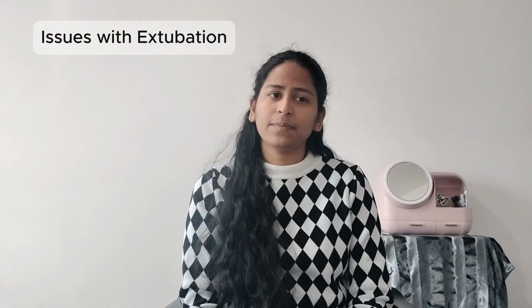Another important thing to remember is always have your bag valve mask or Mapleson C circuit ready while you're extubating. This could mean that any time the patient is desaturating between your extubation and your putting on to the next interface or your re-intubation, you are ready with rescue respiratory support. Then the issues with extubation could be that the patient has upper airway obstruction, which could mean laryngeal edema, which we discussed about, or trauma to the airway, which would lead to, again, airway obstruction.